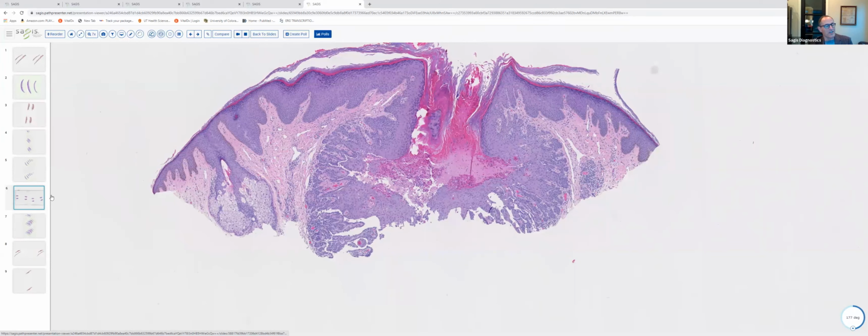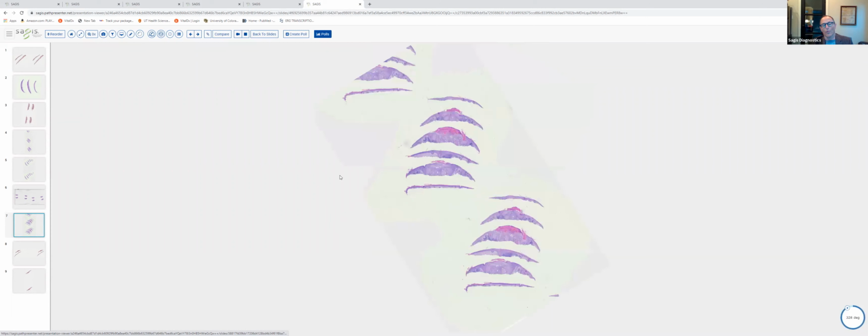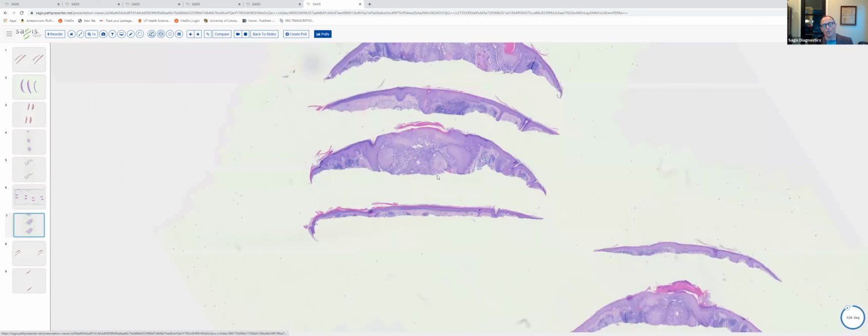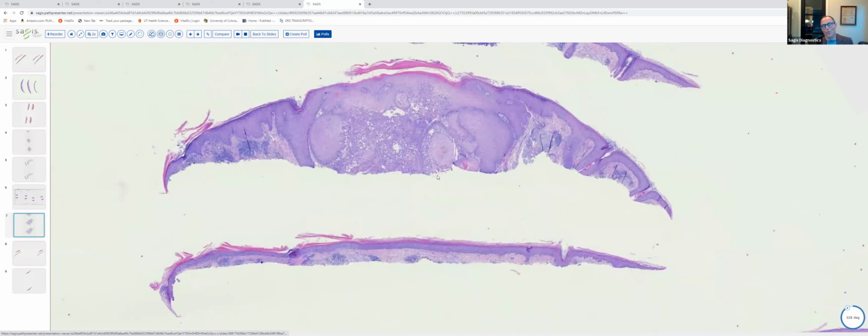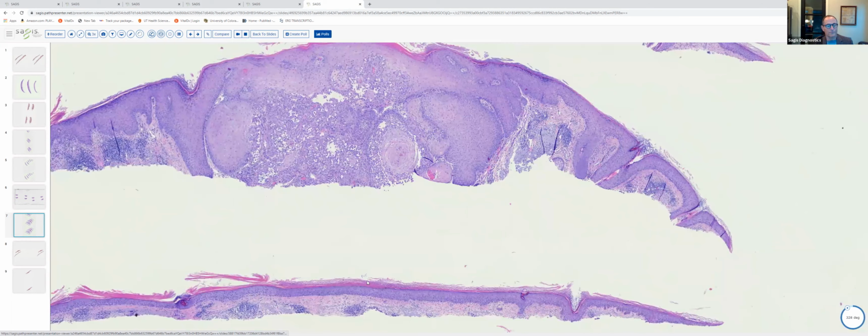Which leads us to slide 7, because one can see acantholysis in neoplastic processes as well. And so on the differential of a warty dyskeratoma, you're probably always going to see included an acantholytic squamous cell carcinoma, which is what slide 7 represented. We've got a dome-shaped papule. This is clearly from sun-damaged skin.